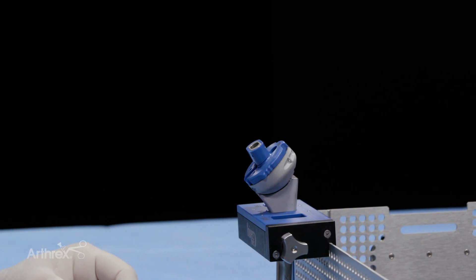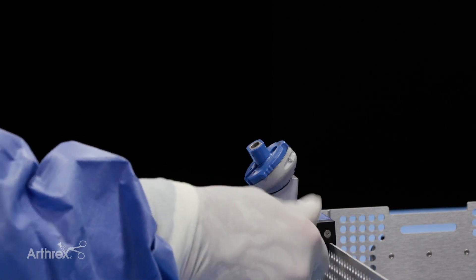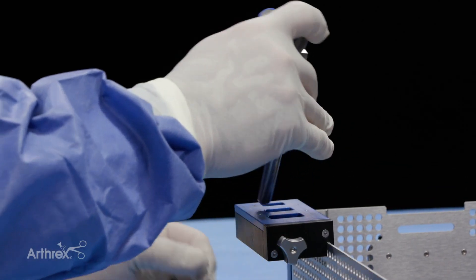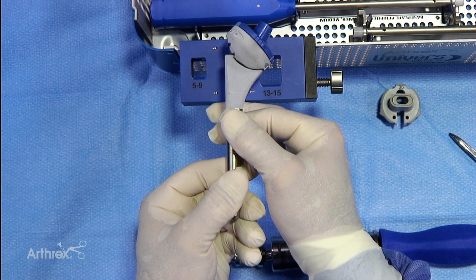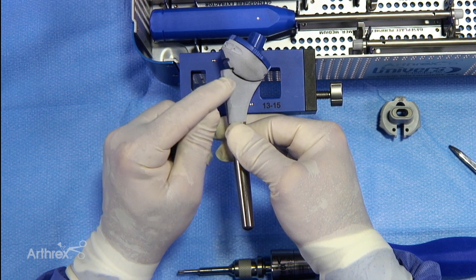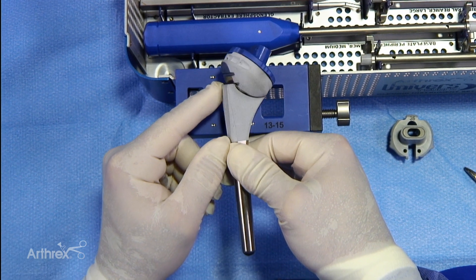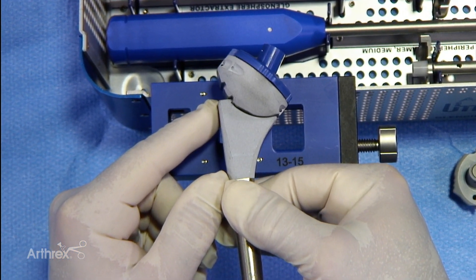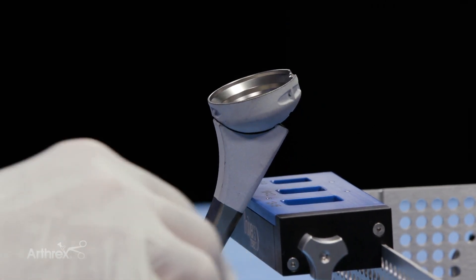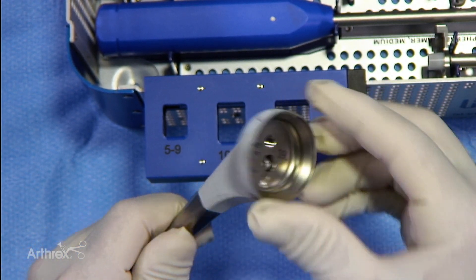Once we achieve the proper torque and tightening of the screw, we can loosen the stand, take the stem out, and carefully check to ensure we've accomplished our goal — which is to have the flange properly seated in the groove for the 135 degree inclination. We see that it's set up very nicely and secure into position. We'll take out our guide, look carefully at this, and now it's very secure and ready to be implanted in the patient.